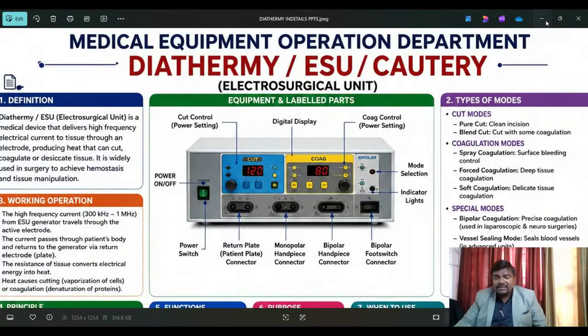First of all, my advice for this one question, I want to give a valuable suggestion. You should be careful, first of all, about electric shock, electric protection. First thing. Next, try to keep the equipment in hygienic condition. First point. Next, second point is every time after surgery, it should be cleaned.